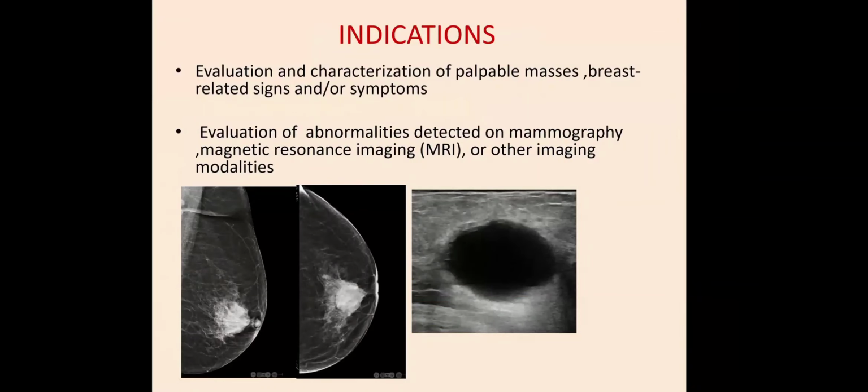Now coming to the last topic of today's lecture: the indications, where all you should do breast ultrasound. These indications you can find in the ACR practice parameter, which was updated in 2021. According to that, you need to do breast ultrasound for evaluation and characterization of a palpable mass, and breast signs and symptoms, whether it's nipple discharge, mastalgia, or redness, whatever signs and symptoms, you can evaluate with ultrasound.